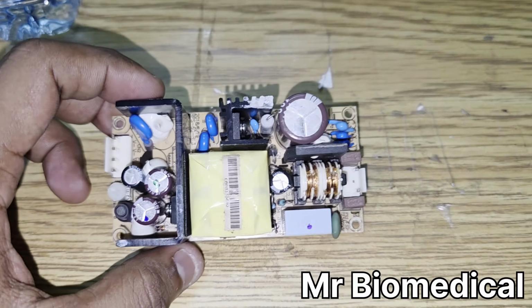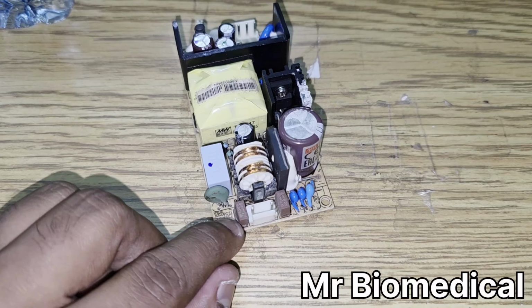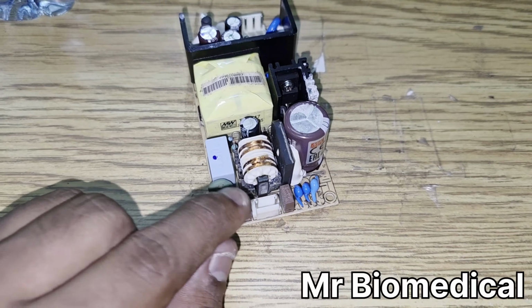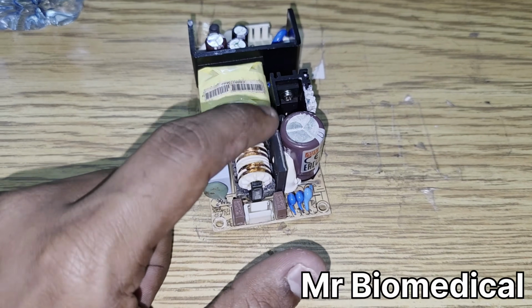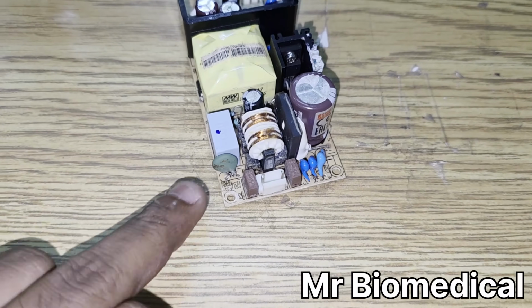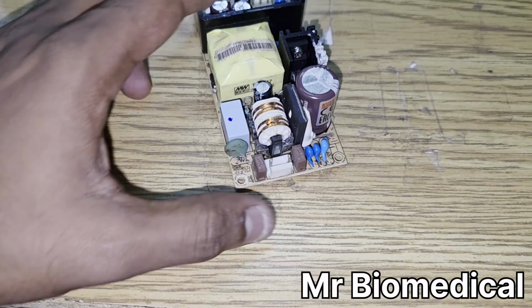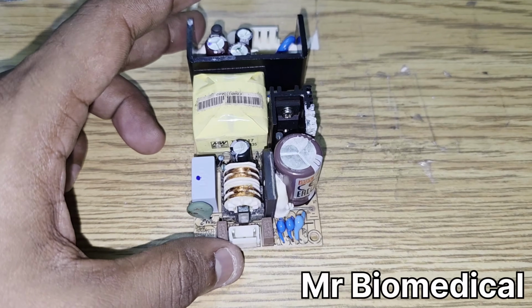The first step is you have to check the fuse always. Why am I choosing the fuse? If you have any short circuit in the board, it will reflect to the fuse, and it will blow. So in this case, I will check, and I'll show you how.